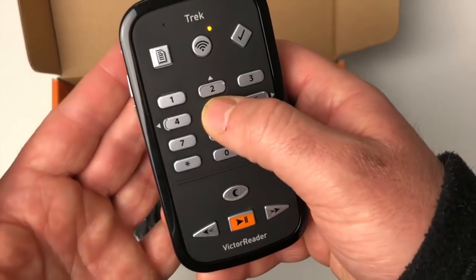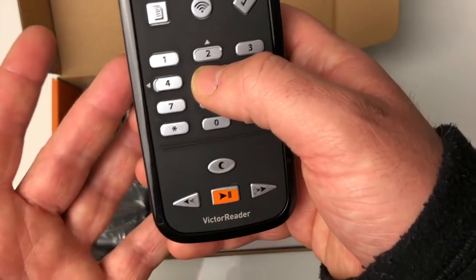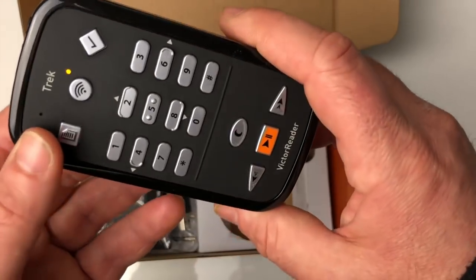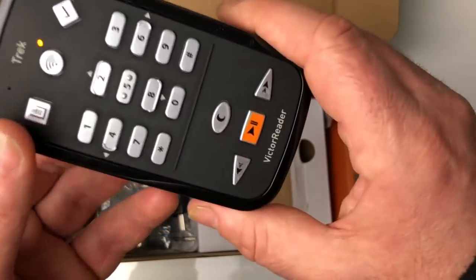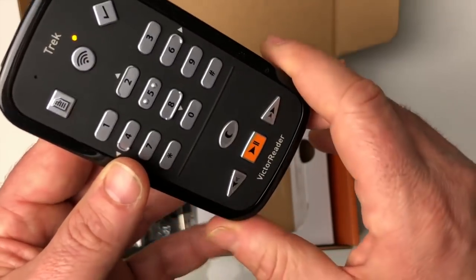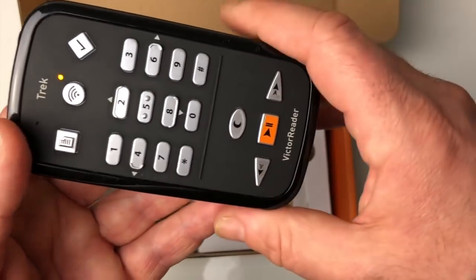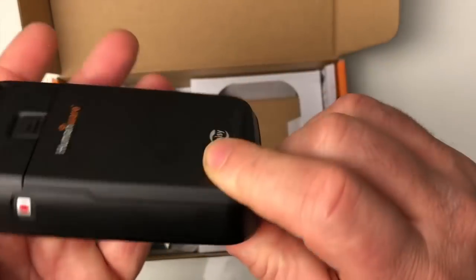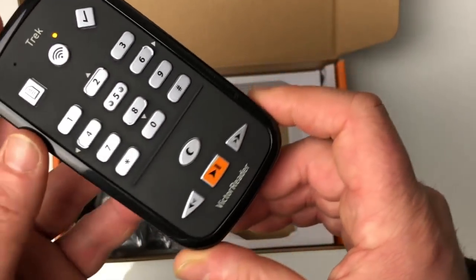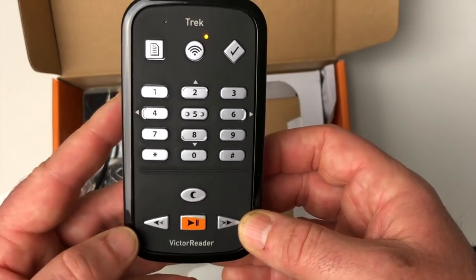La preuve, par exemple avec la touche 5 — pour ceux qui avaient l'habitude du Tracker Breeze, le 5 était la grosse touche en haut. Pas de couverture GPS pour l'instant. On va pouvoir lui demander « où suis-je » via cette touche. On fera ensemble différentes vidéos sur comment construire une route, comment naviguer dans cette route, comment se servir du Victor Trek. C'est vraiment très sympathique, les boutons sont très accessibles. Voilà donc le tout nouveau Victor Reader Trek.